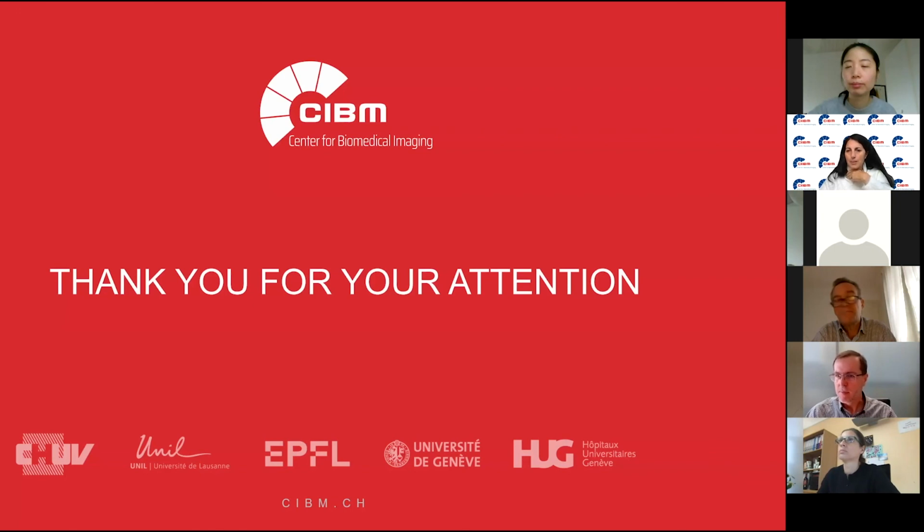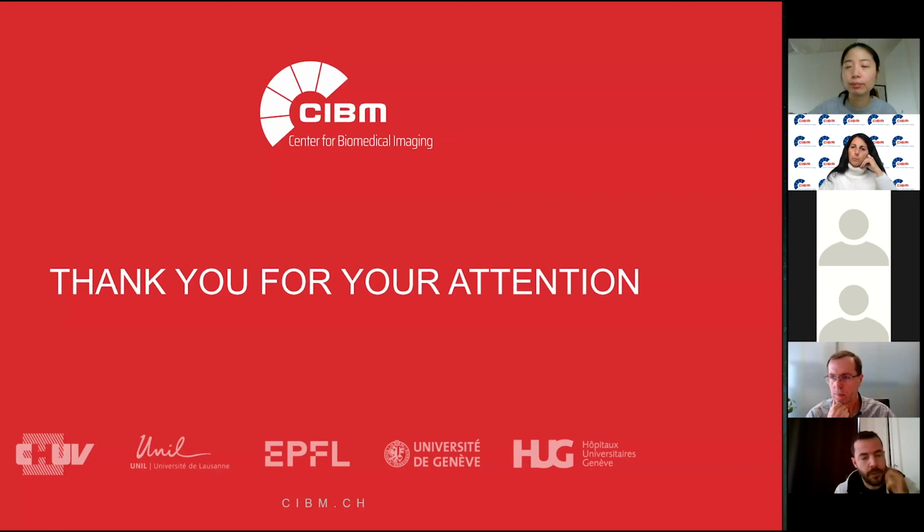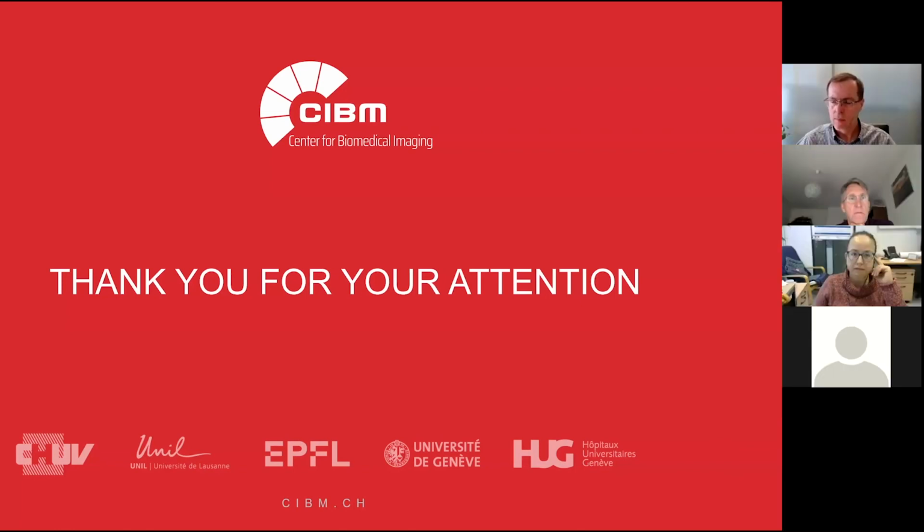Any other questions? Hi. Can I ask a question? Yeah, totally. So thanks a lot for the presentation. I used to work with EEG, now I'm working with MRI, and I was wondering if it's possible, because you were having some problems with newborns with the solution points, instead of using only the gray matter, you were using the whole brain.